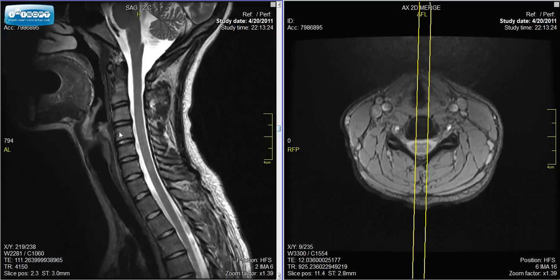The spine is right here. As we saw in the lumbar spine, the larger, lighter areas are the bones, and the spaces between are the discs, which are made out of cartilage.